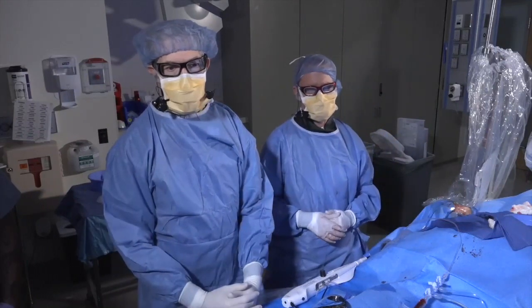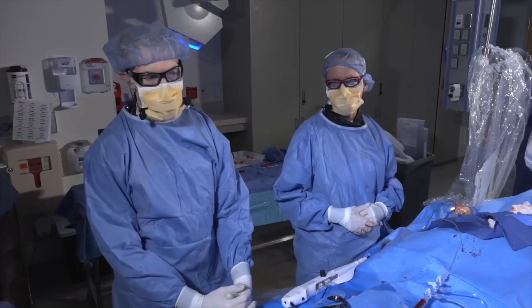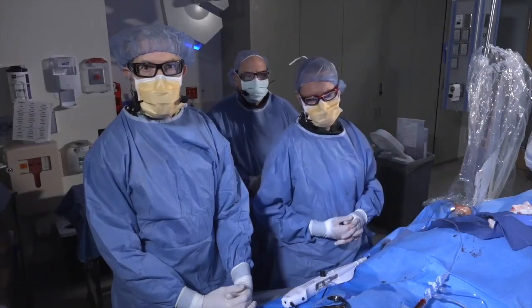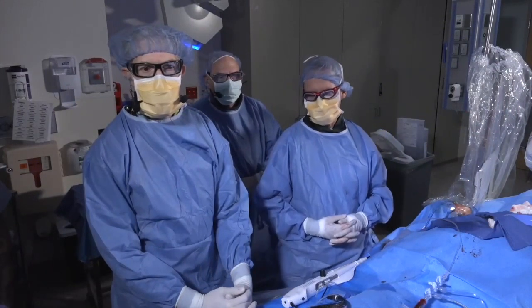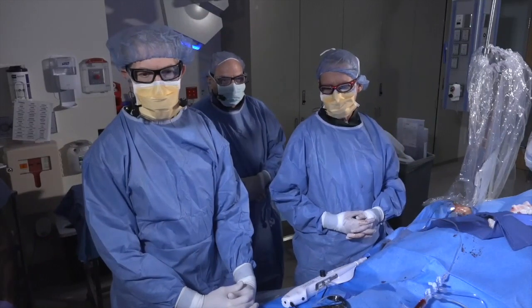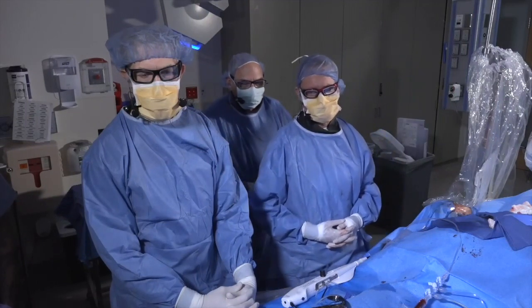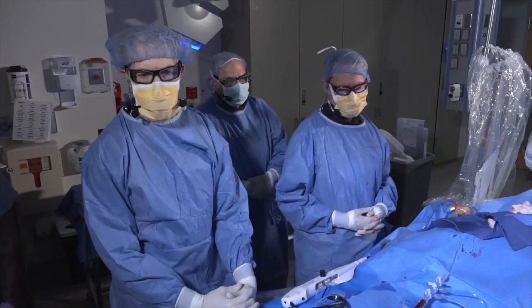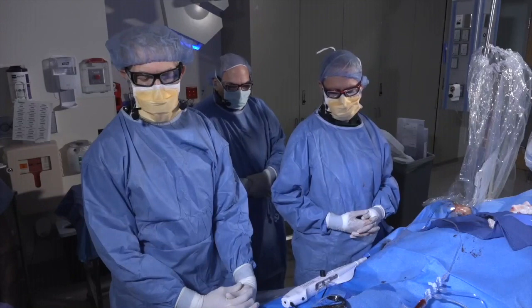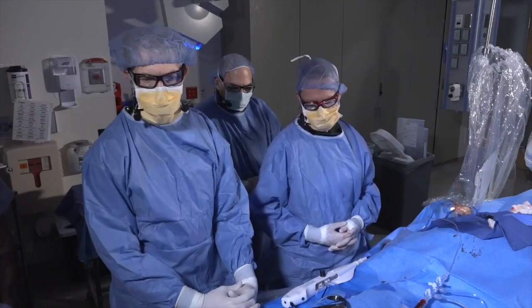So I think you see her in clinic, and clearly there are some issues here. I also wonder with these types of cases, back in 2012 when she went for surgery, the LIMA being non-usable, it's interesting. The surgeons actually don't do cines of what's going on during the operating room, and often unusable LIMA equals transected LIMA, and there was a problem during the case. But with two veins, honestly, at that time in this anatomy, one could argue that with good technique, good operators, percutaneous revascularization might have been entertained at that point as well.